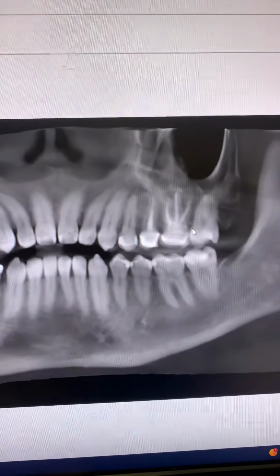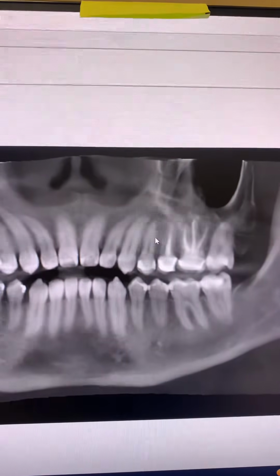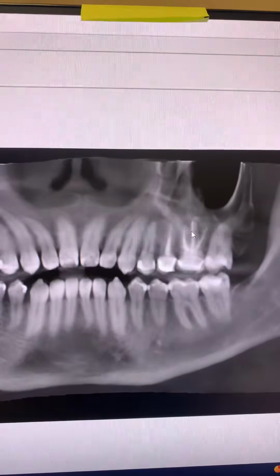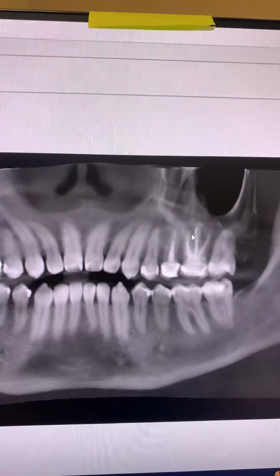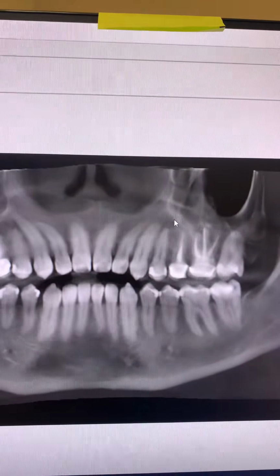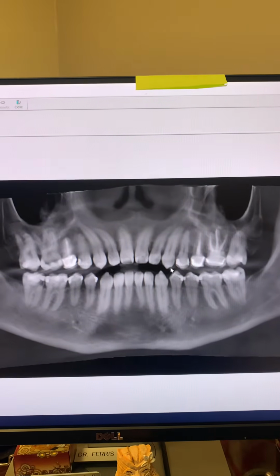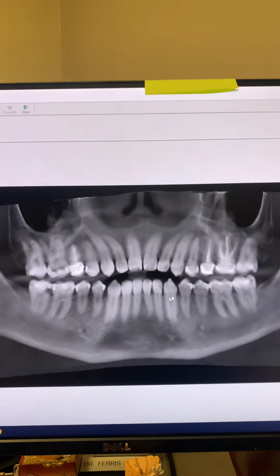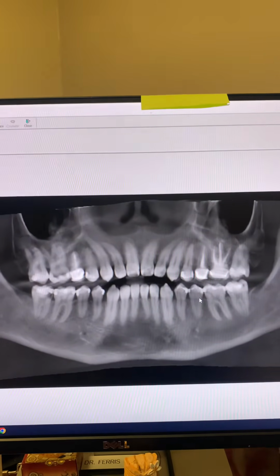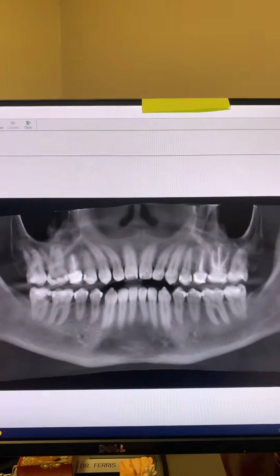Look at tooth number 13. Again, based on the panel, there may or may not be something going on. I don't know. Previous root canal. Look at tooth number 14. Previous root canal again. Is there something going on here? Look at tooth number 12. Is there something going on with tooth number 12? That's why, again, you cannot rely on a panoramic radiograph for endodontic purposes. You need to take periapical radiographs. Don't use panoramic radiographs for endodontic purposes.